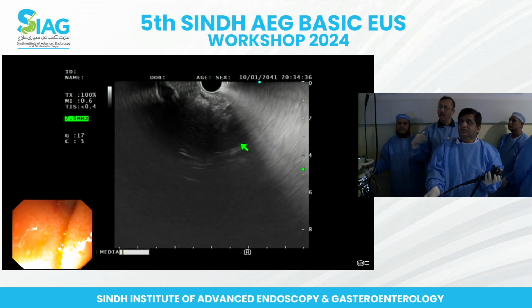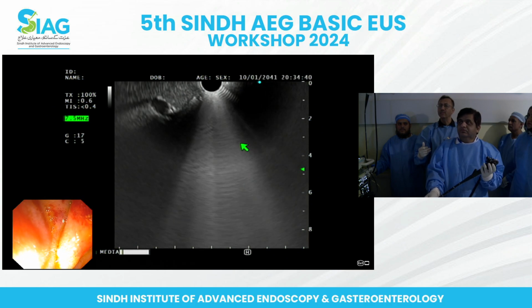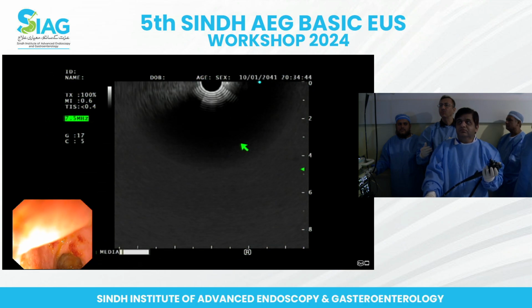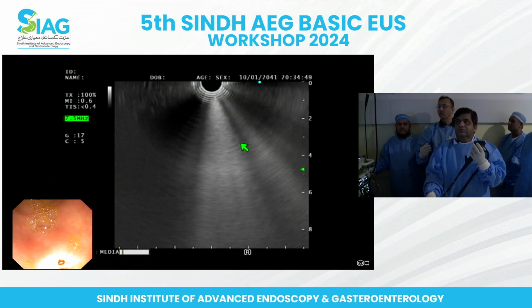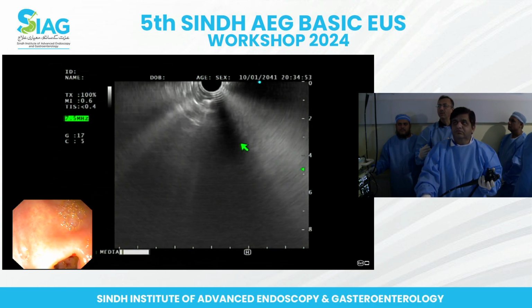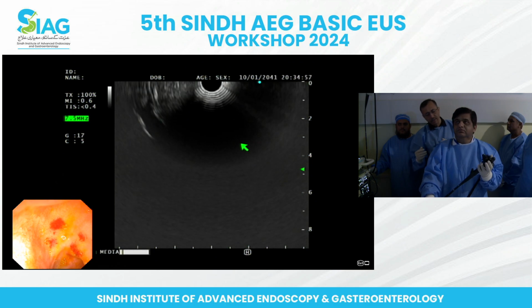and intubate once again. And the moment you go inside the pyloric opening, that's the time you should be able to visualize the portal vein. So once again, with the long scope in, don't go too far in, and now suck all the air.